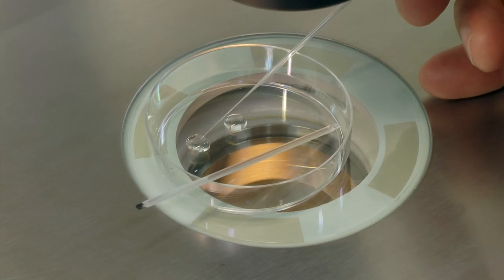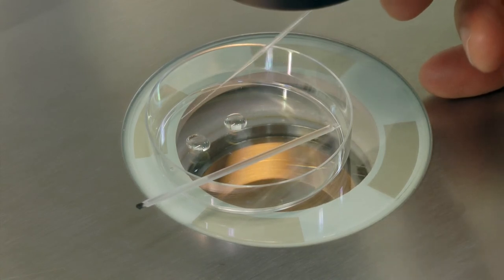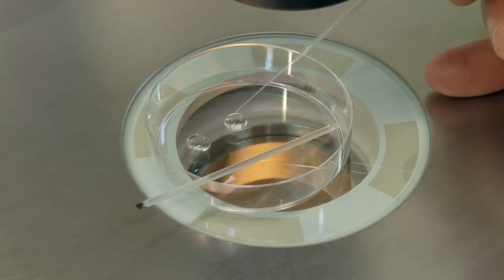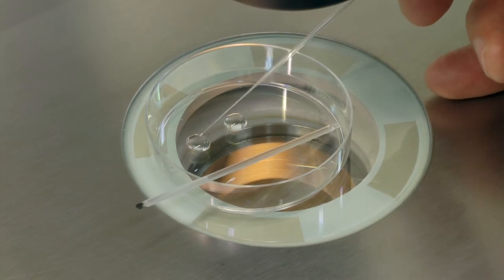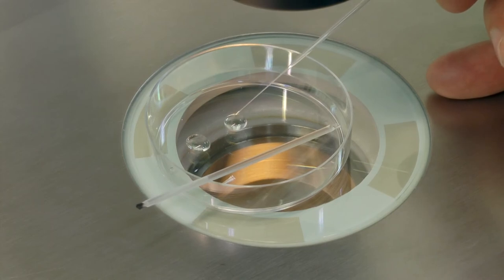Prime the pipette with the third solution and move your blastocyst from the second solution into the first droplet. Empty your pipette outside of the droplet and prime it again from the second droplet. Move your blastocyst immediately from the first droplet into the second droplet.